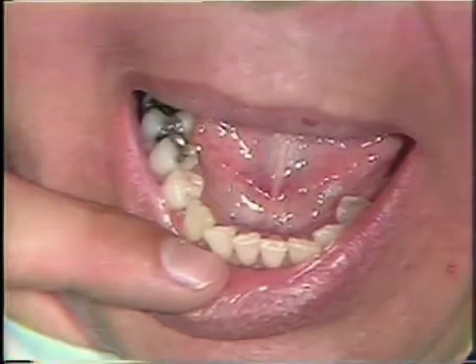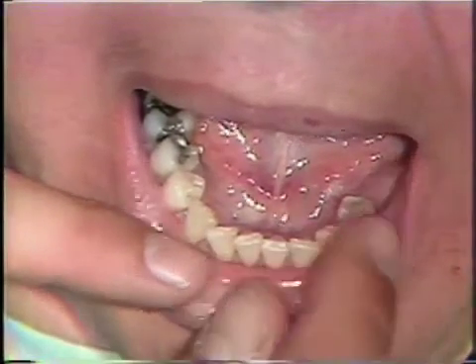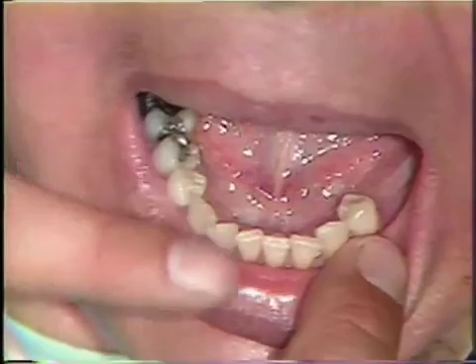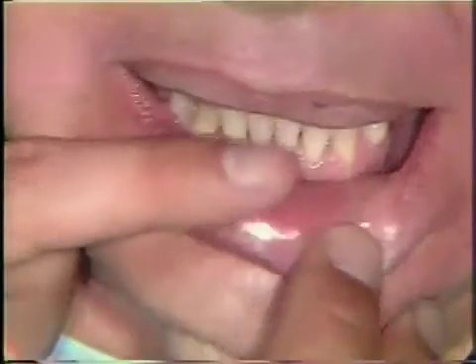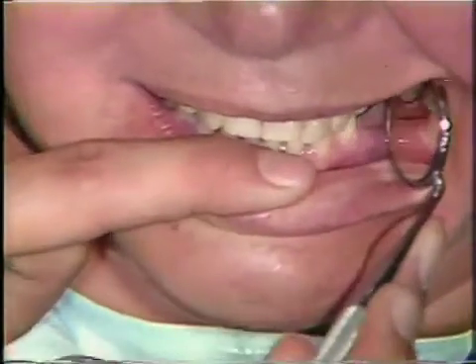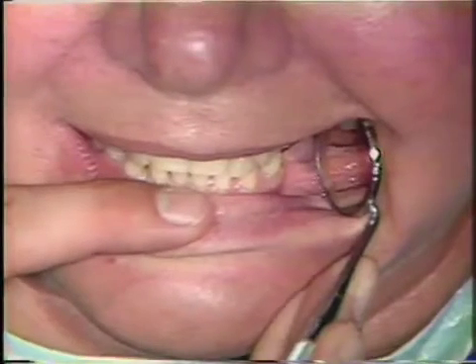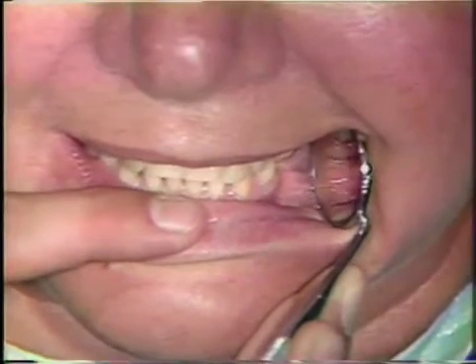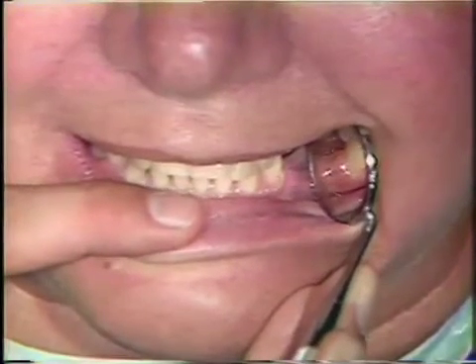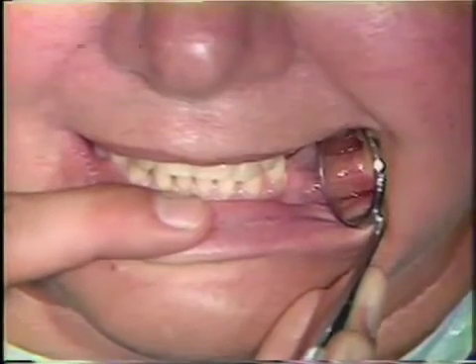One last check, and a very important one, is that we should check to see if we have clearance with the occlusion — with the teeth in occlusion — for the rest seats. We should be able to see that there is room for an occlusal rest to be interposed between the bicuspid teeth. If there is not, additional clearance would have to be made at this time. There is clearance here, and now the next part of the mouth preparation would be to prepare the axial surface.